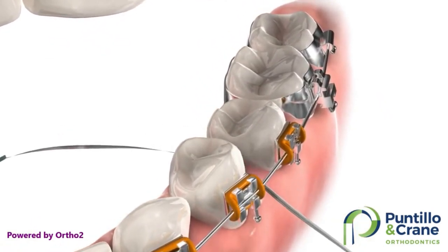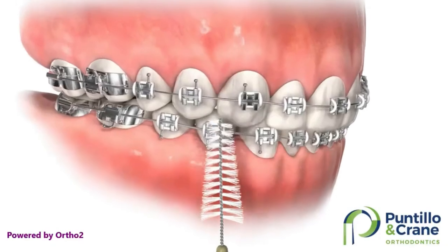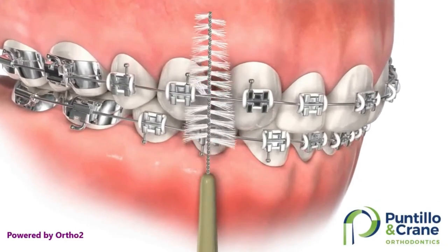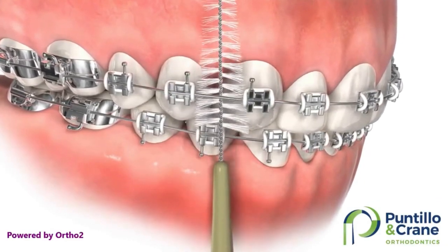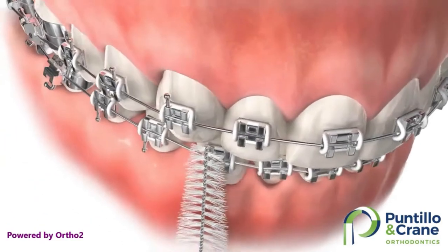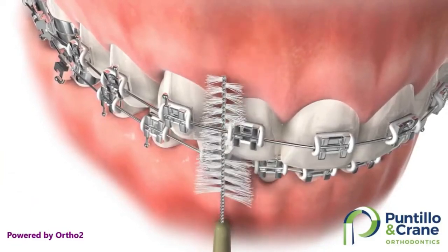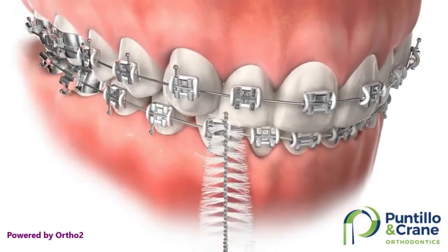Let's talk about your proxy brush. You can use it to loosen food particles, remove plaque, and stimulate your gums. Gently push the bristled end under the arch wire between the brackets. If it is hard to push the brush into an area, don't try to force it because you might accidentally break a bracket. Only use it in areas where you can be sure to use it gently.